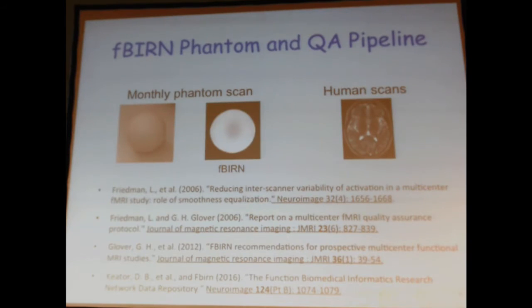So if you want to find out about scanner effects and get rid of all that annoying human stuff, which just makes it really hard to see scanner effects, the best thing to do is take away the human and replace them with something inert, unless you have an inert human available. Actually, I shouldn't joke, because there are a couple of papers scanning cadavers, but we couldn't get a cadaver, at least not across the 13 sites in Canada, and shipping one around seemed logistically to be a bit of a challenge.